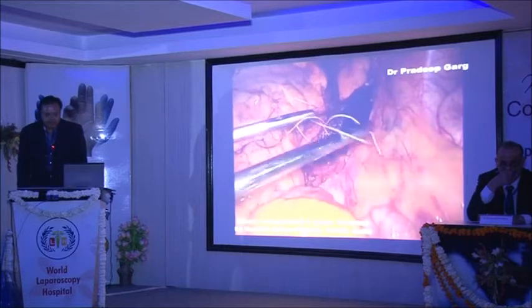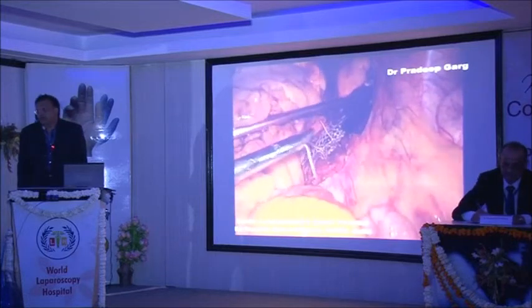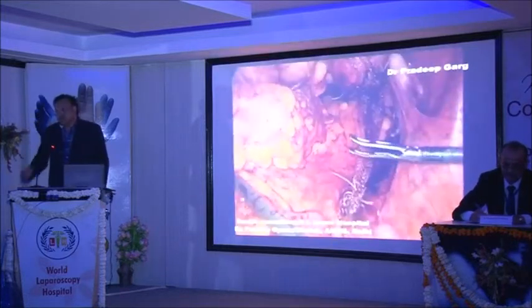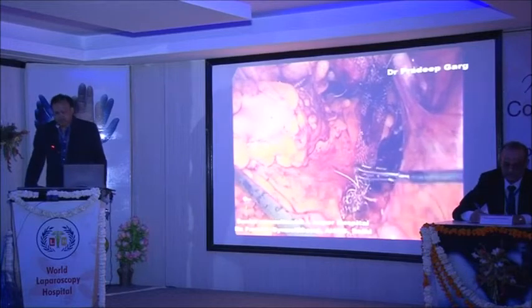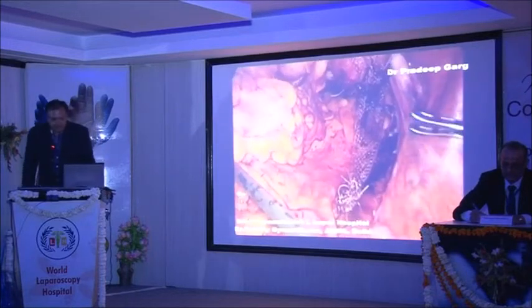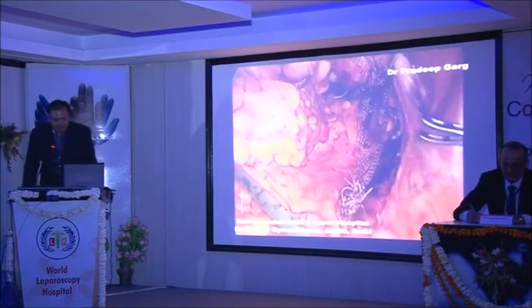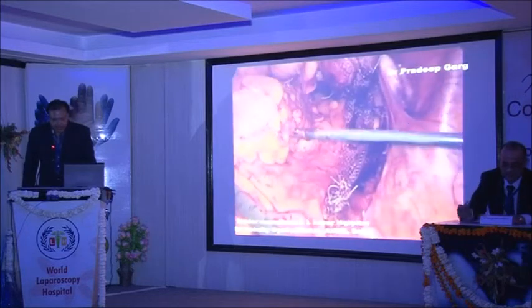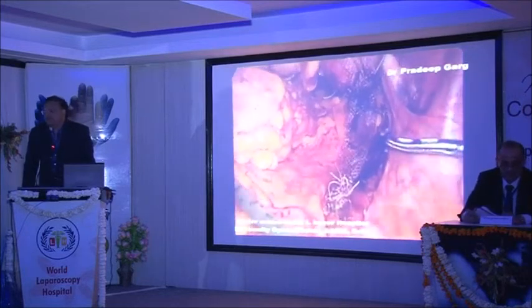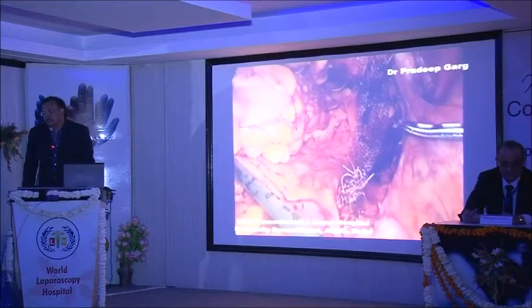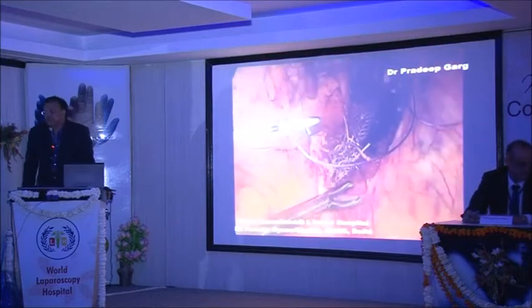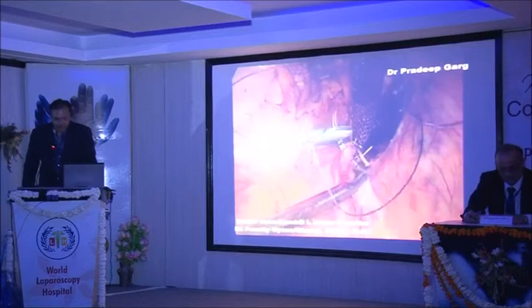Take three to four sutures, and if you are not comfortable with this suture, you can use a tacker. This is the final picture of the mesh — you can appreciate it. Then you cover this mesh with the peritoneum, cutting from the sacral promontory to the right utero-sacral ligament with the help of a bipolar.